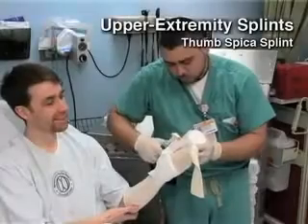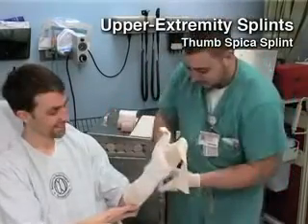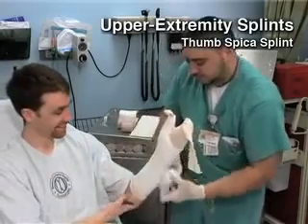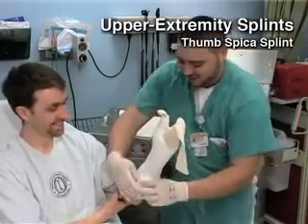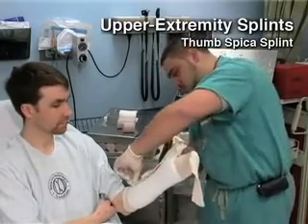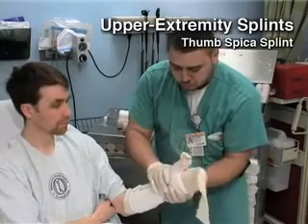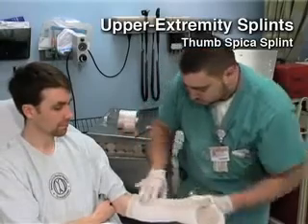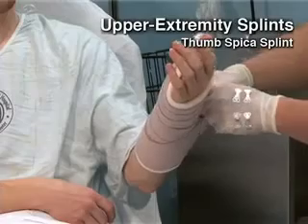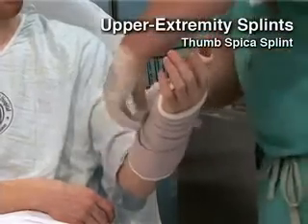Thumb spica splints are applied to the radial aspect of the forearm to immobilize the thumb and prevent flexion and extension of the wrist. This splint is useful for fractures of the scaphoid and lunate, first metacarpal, and thumb. It extends from the tip of the thumb to the proximal forearm. Place the forearm in a neutral position with the wrist in 20 degrees of extension and the thumb slightly flexed.